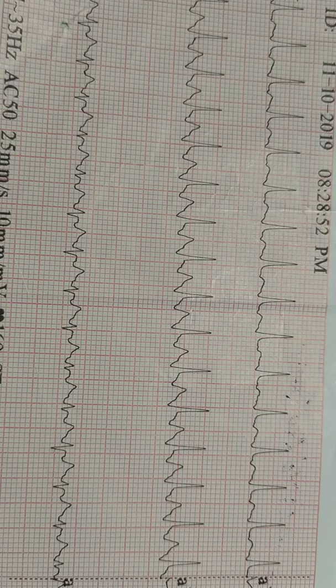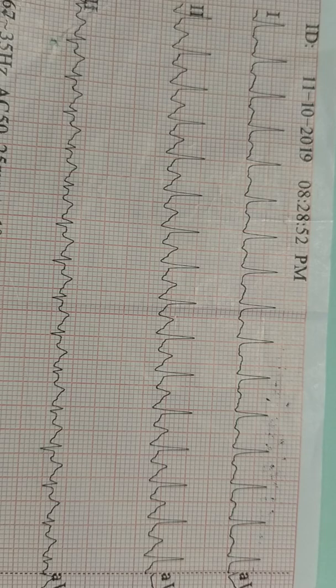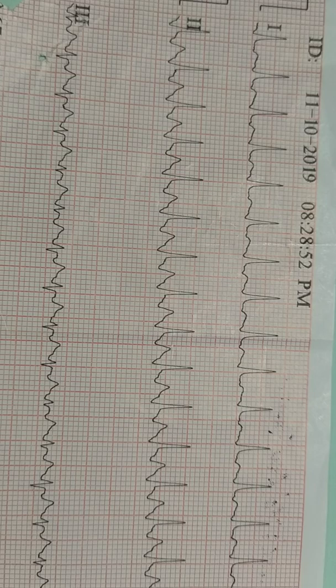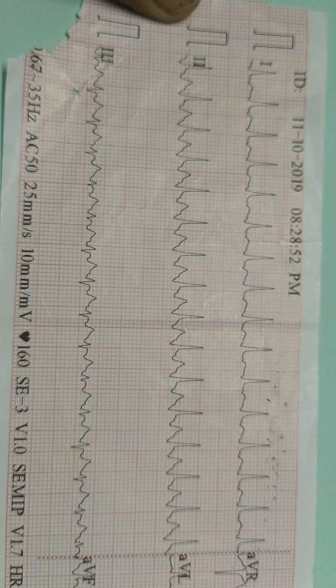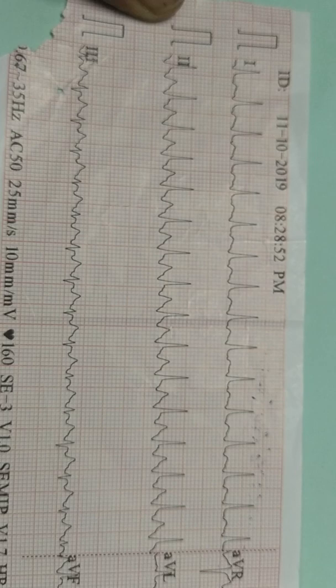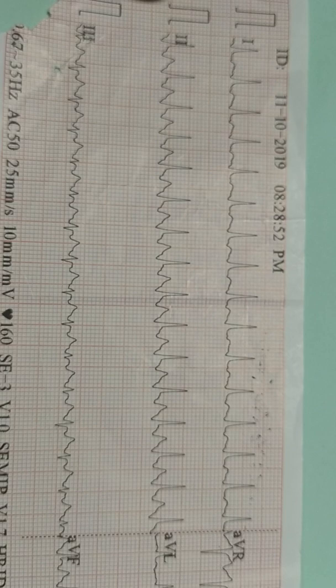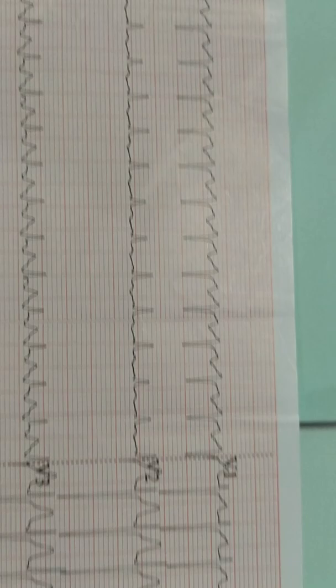Next, P wave is absent. The QRS complex is narrow. So: P wave absent, narrow complex, and regular rhythm. We can say that this ECG is showing narrow complex tachycardia — narrow complex tachycardia with P wave absent and regular rhythm.